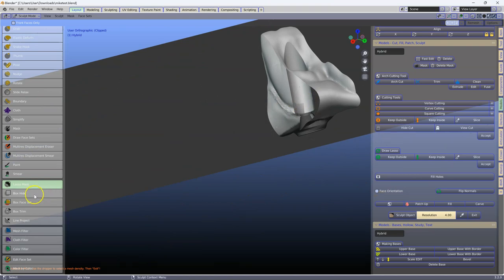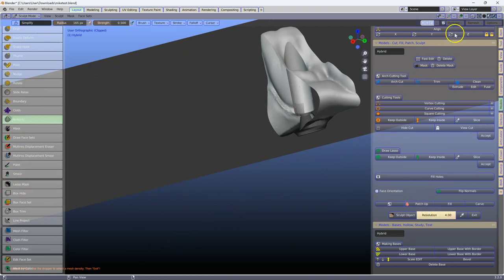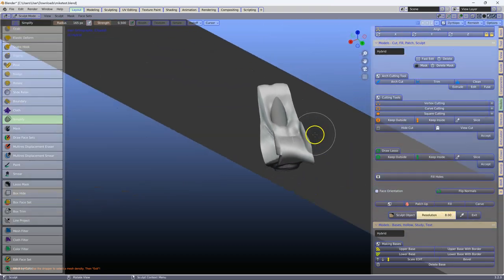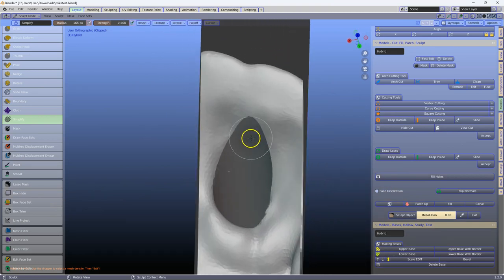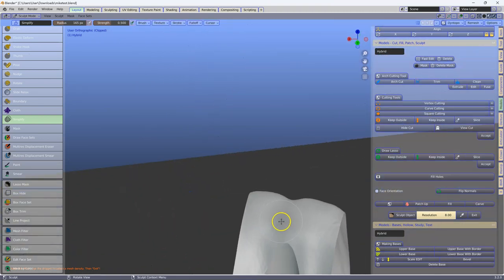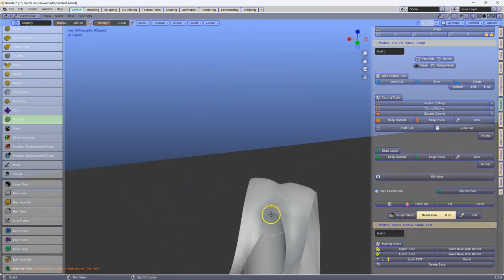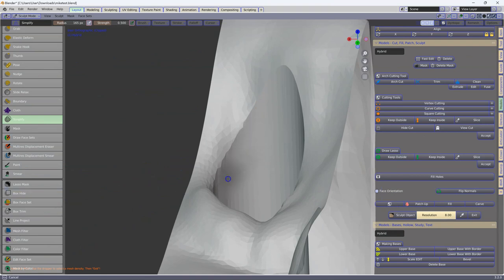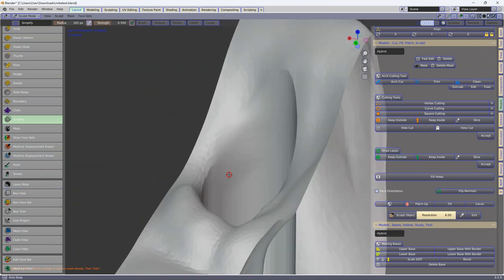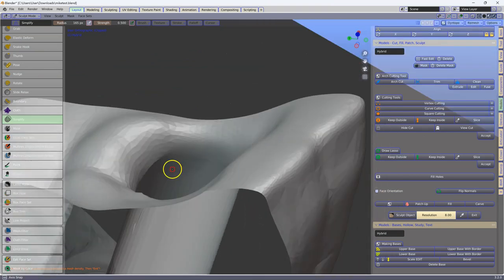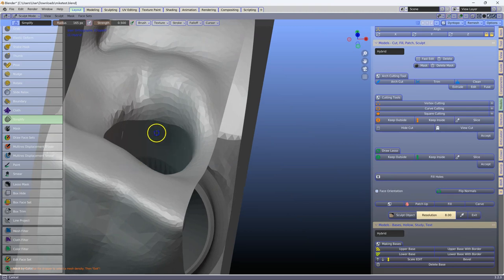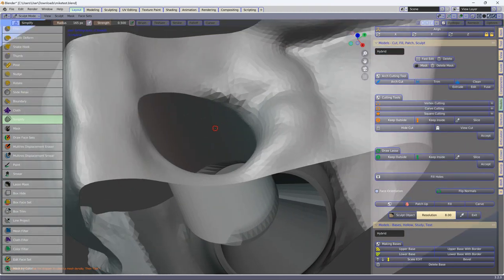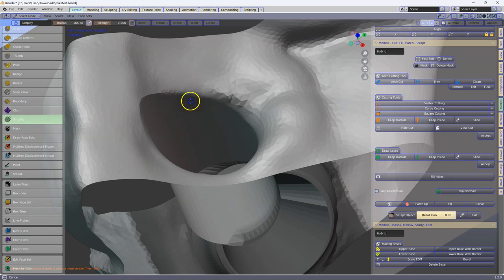Next I'm going to select the simplify, and make sure the dyntopo is on, and we're going to make this a little bit finer, say around 8. Then I'm going to zoom in, and we're going to correct this mesh structure. So just paint this and re-sculpt it. Now I don't have to worry about the bottom of it, because that's been masked.